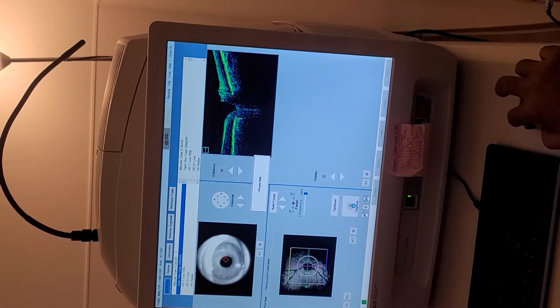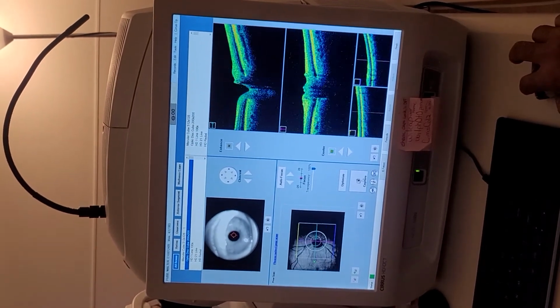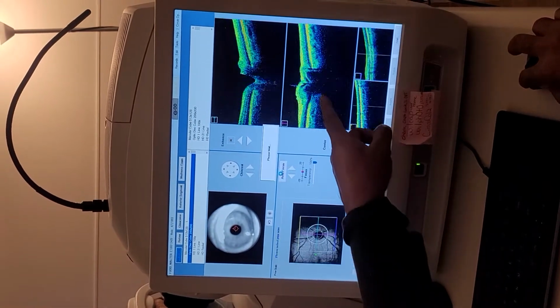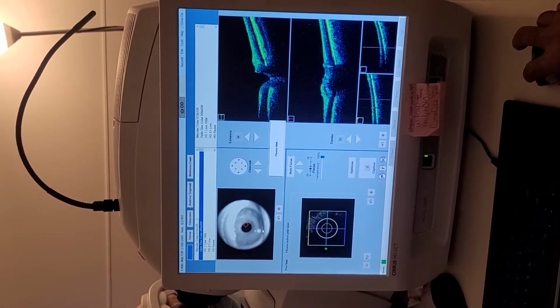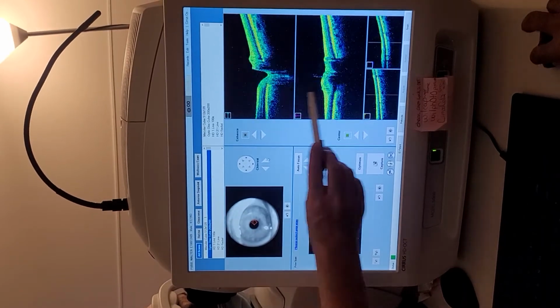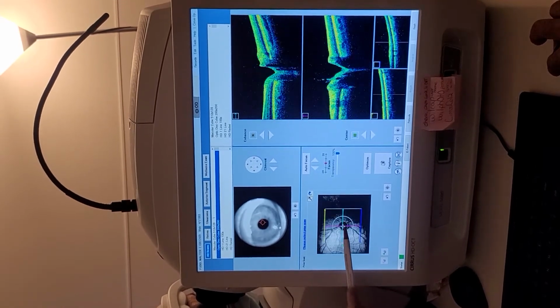But you wouldn't necessarily have to because your image was good. But I want you guys to get the feel for the buttons. Now, what else are you gonna do? Autofocus, just so you can get used to it and see if you can get a little clearer image. Make sure you have your dip, and right here you can move this over, so you can move that whole square and get that in the center.